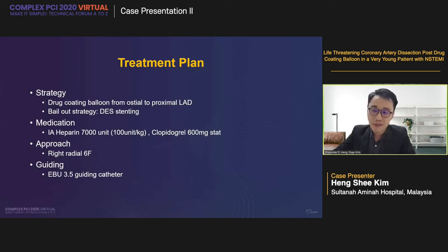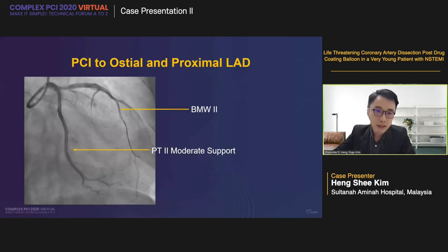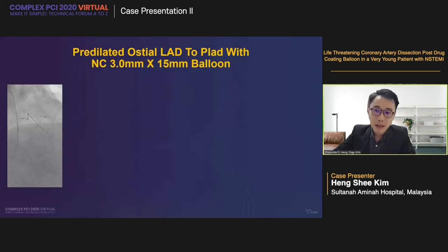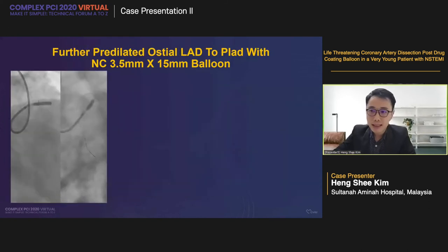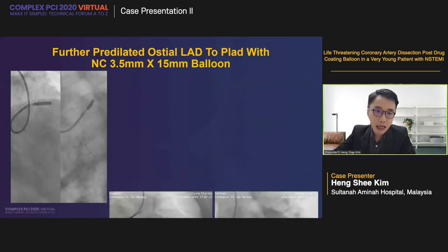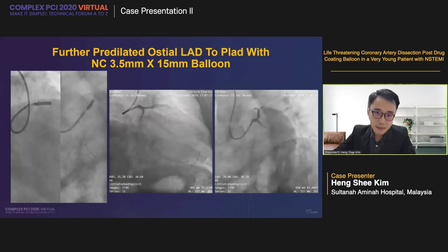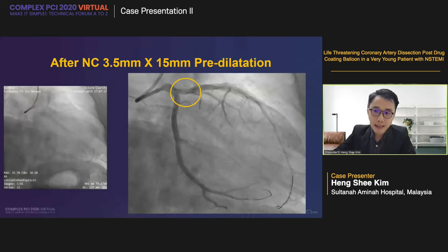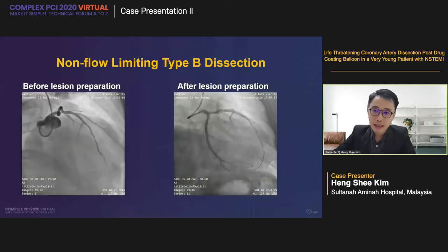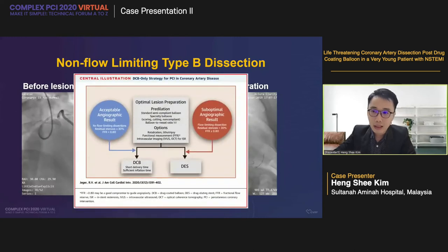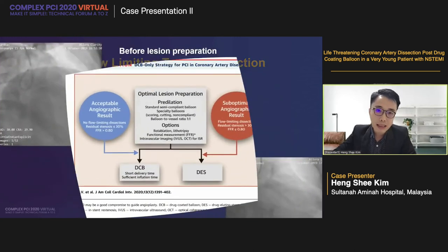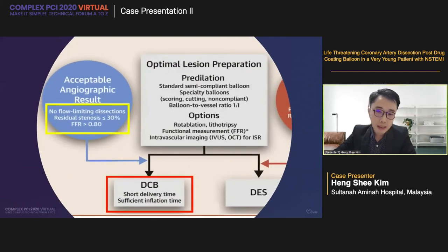We started with intra-arterial heparin 7000 loaded, right 6-French radial approach with an EBU 3.5 guiding catheter, wired to LAD with BMW 2, and PT2 moderate support to the circumflex. We dilated the proximal-to-ostio-LAD with a 3.0×15 non-compliant balloon at nominal pressure, then upsized to NC 3.5×15 at nominal pressure at the proximal and 12 atmospheres at the ostio-LAD. After NC 3.5 pre-dilatation, we noticed a type A to B coronary artery dissection — however, there was still a non-flow-limiting dissection. The residual stenosis was less than 30% with a type A to B dissection.